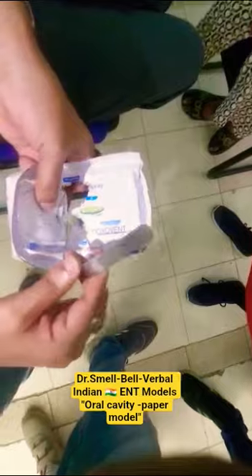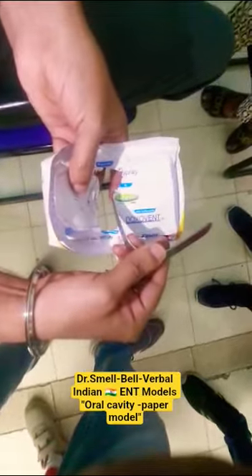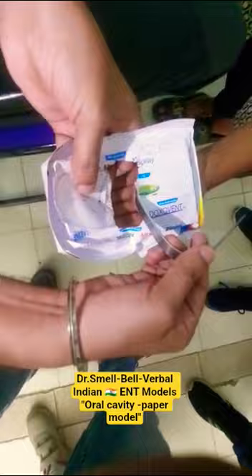And when the patient is supine like this during tonsillectomy surgeries, you have to use the tongue depressor on the other side and you can lift the soft palate and see the nasopharynx also like this. Okay, put the hand down. So this is the nasopharynx which you are able to see behind the soft palate.